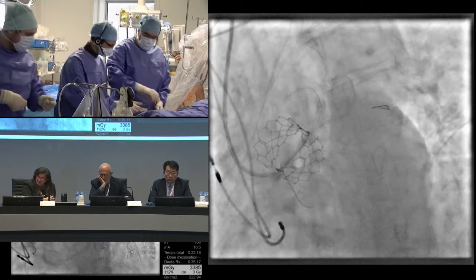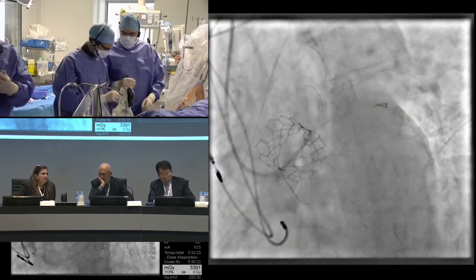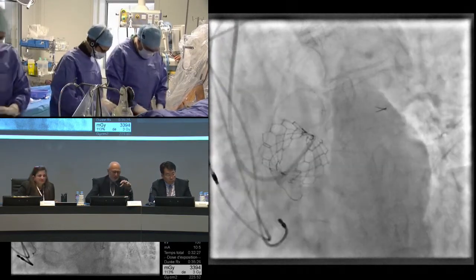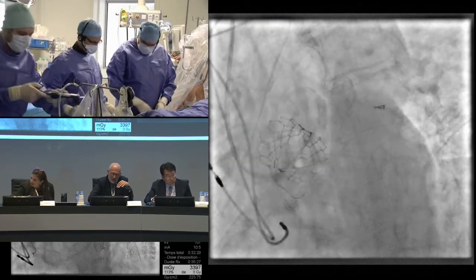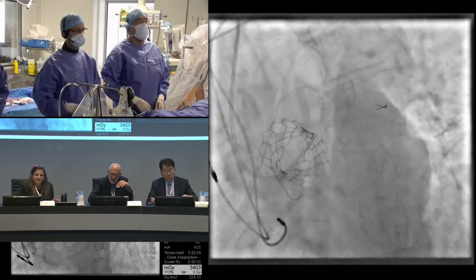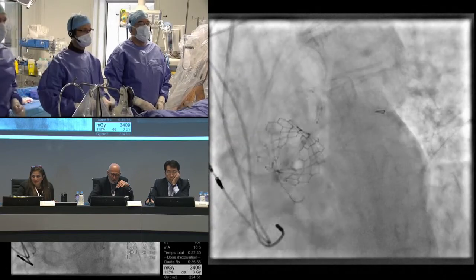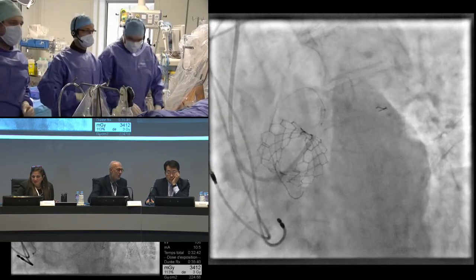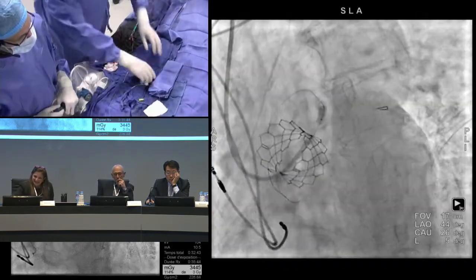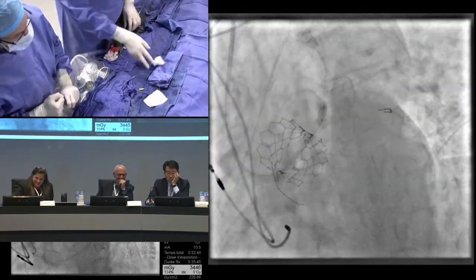LAD is this one. Yeah, because you only went up to 12. I follow your advice. Or you could just do IVUS if you wanted. I think it is important to do IVUS in this case, since there is heavy calcification and the expansion of the stent is not guaranteed by high pressure. So I think IVUS will be needed here. Yeah, but I agree, but you know... If with the IVUS we take 20, 25 atmospheres, and then what to do? We have no other option.